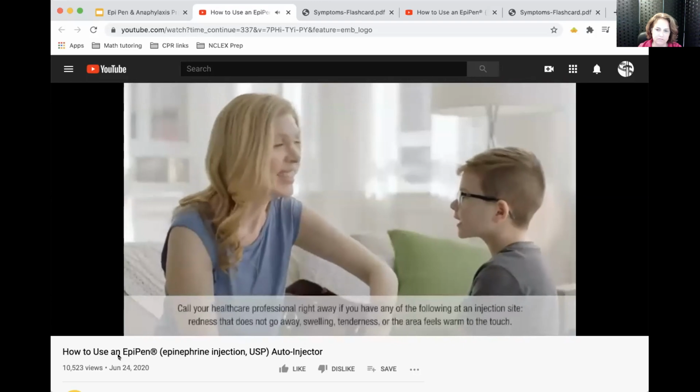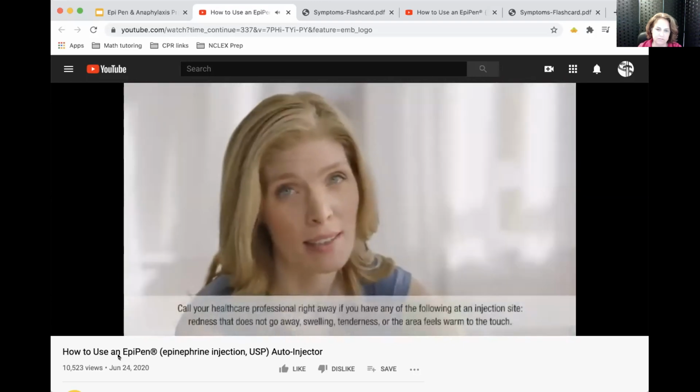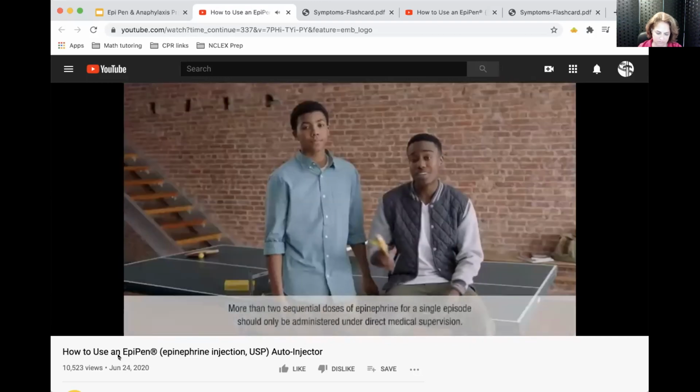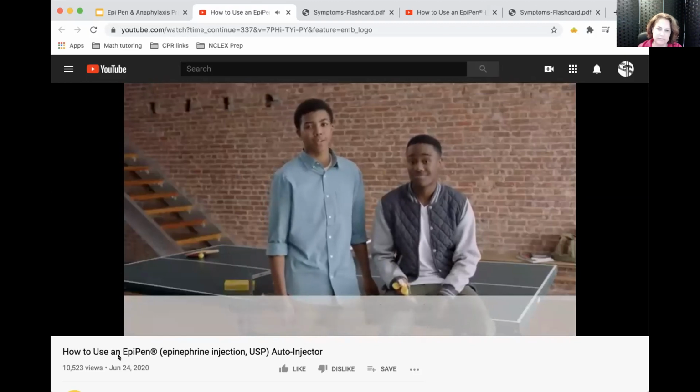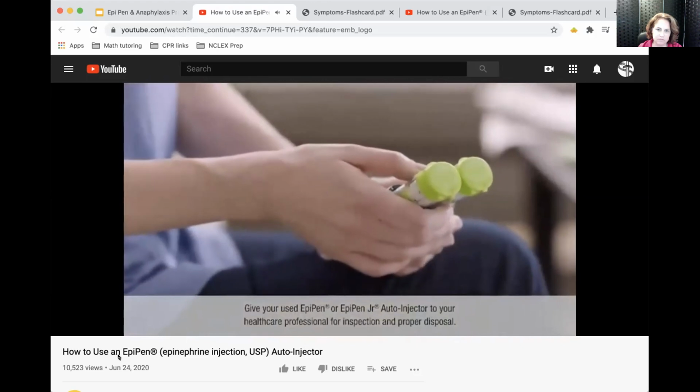Call us an ambulance. Or have someone take you to the emergency room. Just make sure to do it immediately. And you should always carry 2 EpiPen auto-injectors wherever you go. They even come clipped together because some people might need the second dose. Take your expired or used EpiPen auto-injectors to your doctor's office and ask for a refill.